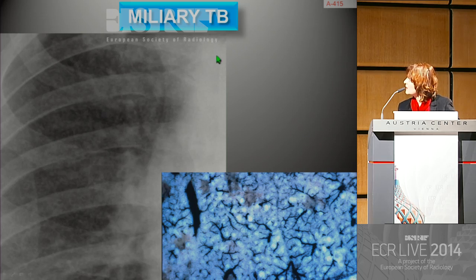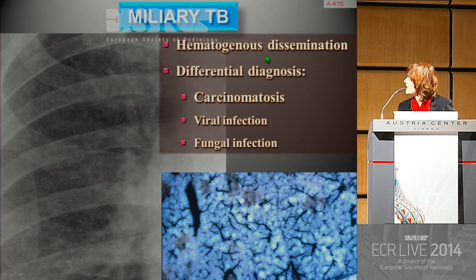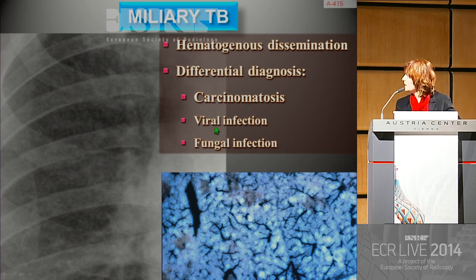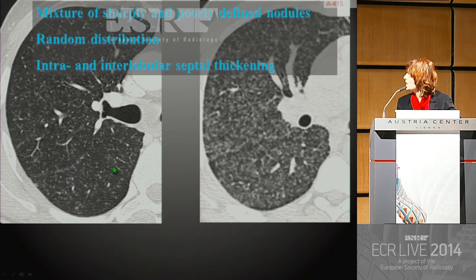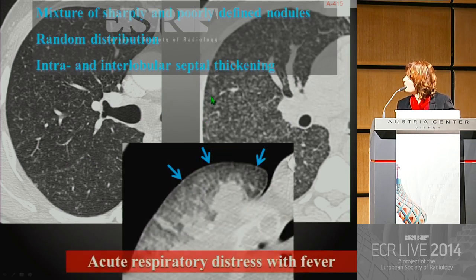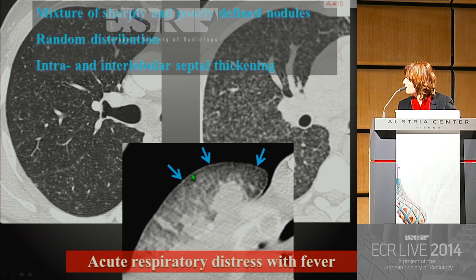A few words about miliary disease. Miliary disease corresponds to hematogenous dissemination of viable bacilli. The differential diagnosis mainly includes metastasis and, in immunosuppressed patients, viral or fungal infection. The CT appearance is a mixture of sharply and poorly defined micronodules with a typical random distribution. Note the micronodules along the fissure, which are never seen in bronchogenic distribution, and micronodules along the pleura, typically encountered in miliary disease.